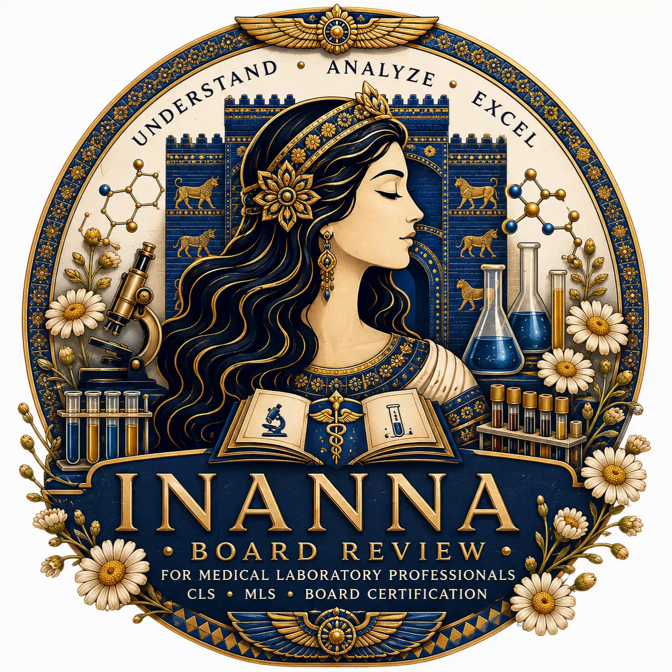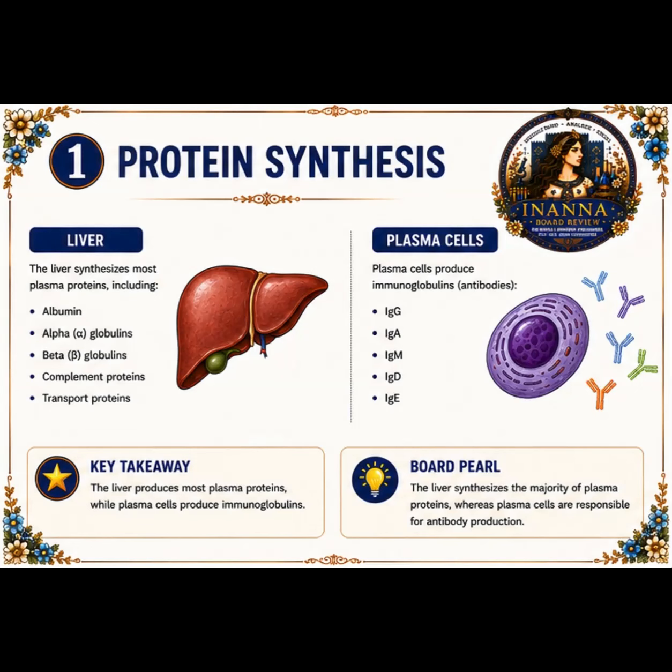In this lesson, we will review protein synthesis and serum protein electrophoresis, also known as SPE. This topic is important in clinical chemistry because protein patterns can help identify liver disease, kidney disease, inflammation, immunodeficiency, and plasma cell disorders.